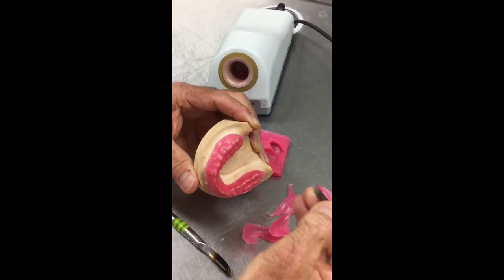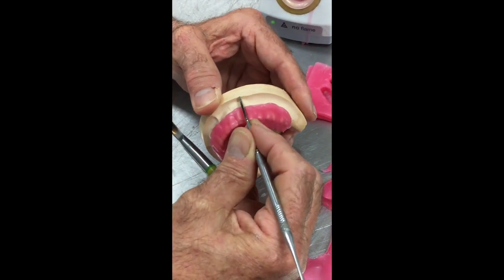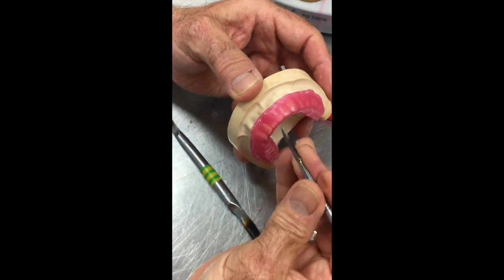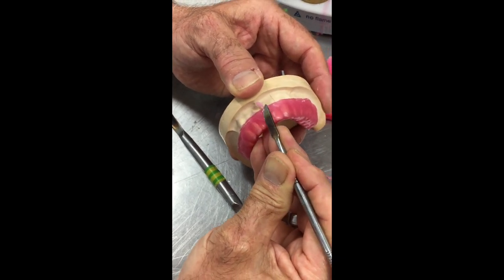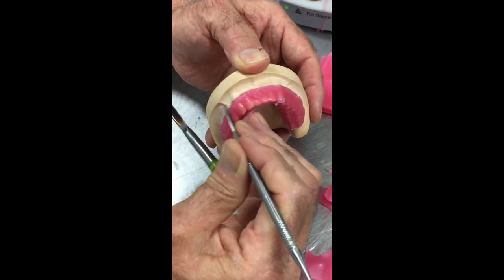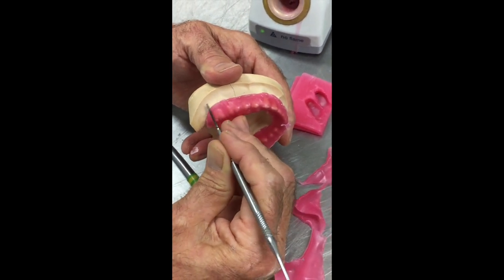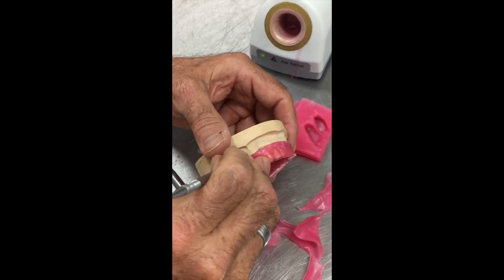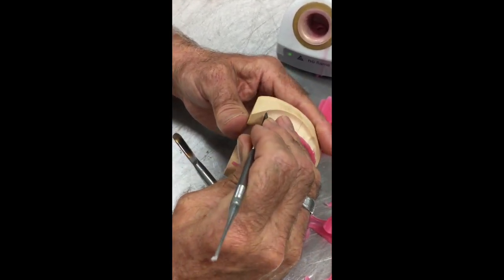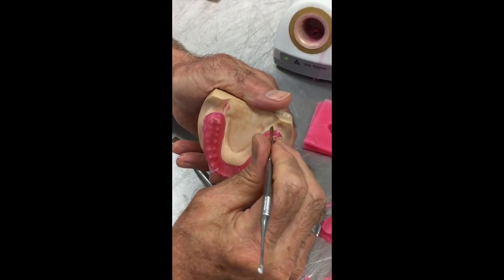Okay, I like to then go around and remove the little beveled or knurled edge that's turned up by the cutting process. It's just a fine edge. And when I do that, I'm looking for areas where the wax folded over itself, and I just remove one of the thicknesses of that wax. So in one or two places where the wax folded over itself, you're just going to take it back to the one thickness, taking that little sharp edge off. You might notice that I'm not rounding the edge. I want this edge to be nice and sharp, right angle, so that it marks my tray material, so I know exactly where to trim my tray when I adapt it. Okay?